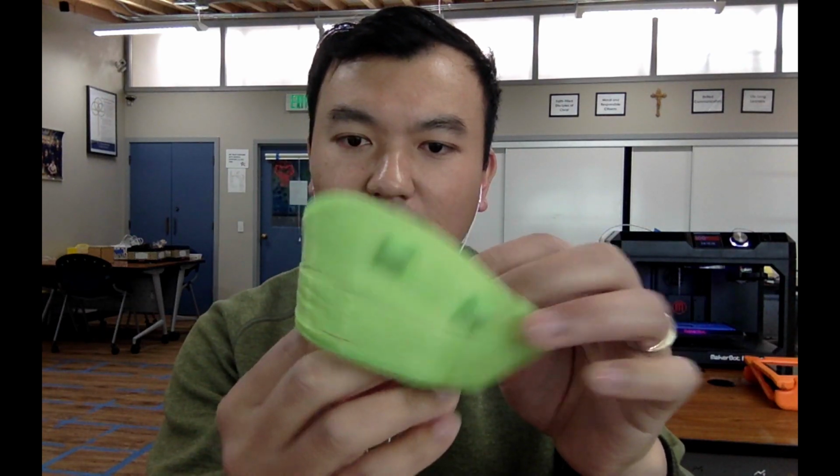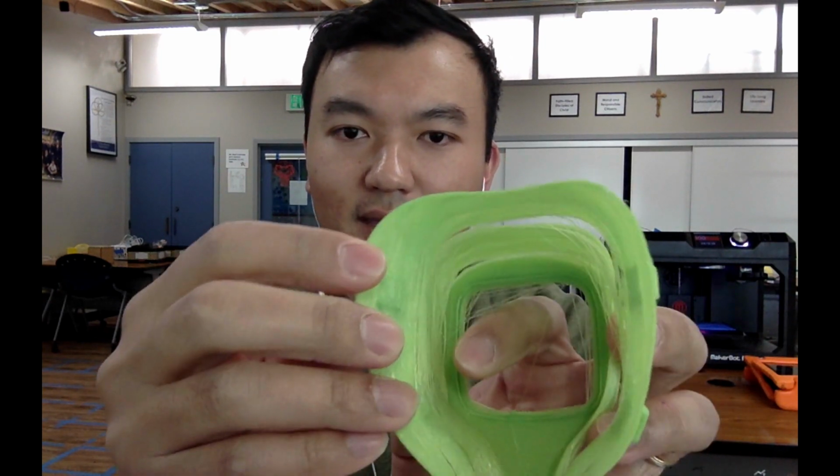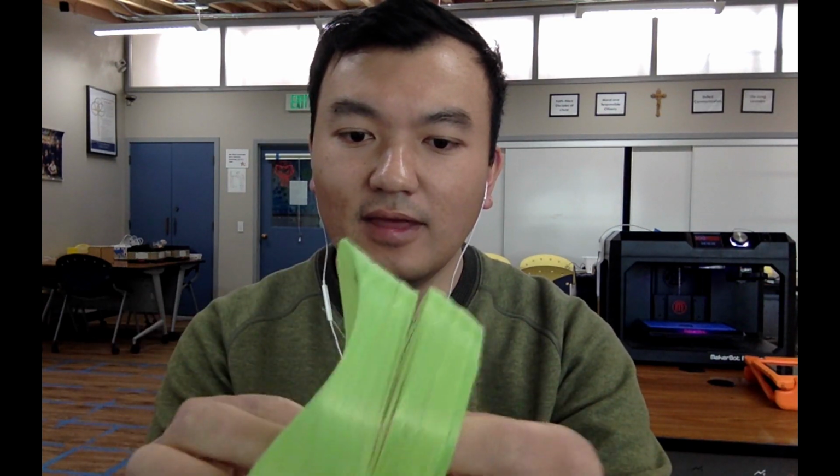Hey guys, we're back, and this is the result of my first print. As you can see right now, it's a little bit loose. The reason for that was that I decided to print it too fast by lowering the quality of the 3D print. Because the face mask is so thin right here, the PLA filament's not really sticking together. So I'm going to have to give this another try, increasing the quality, and that's probably going to increase the print time, which is okay, but preferably I want it to print as fast as possible. So let's give this another try.